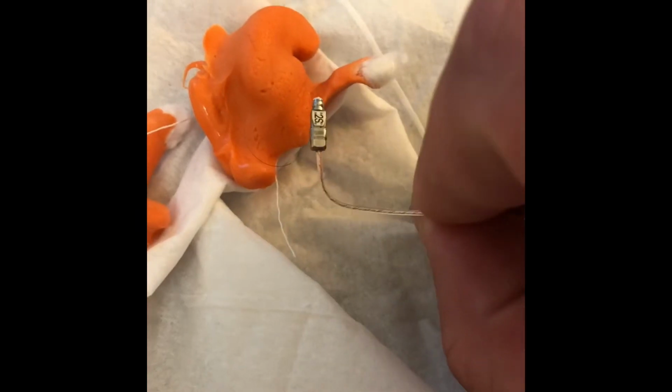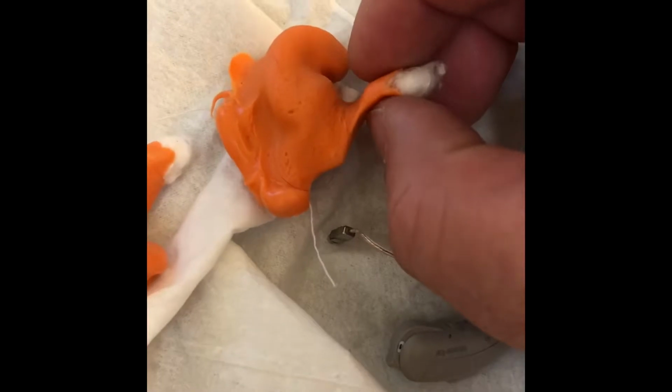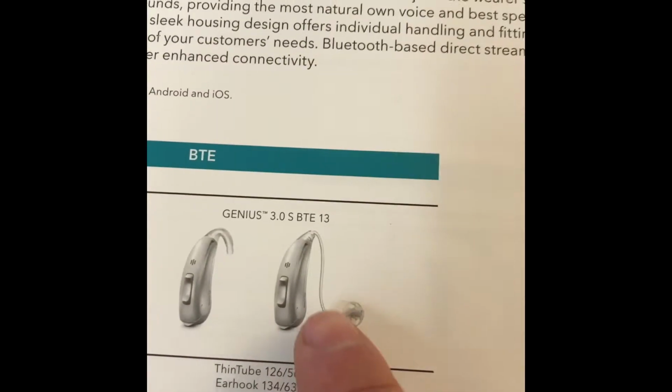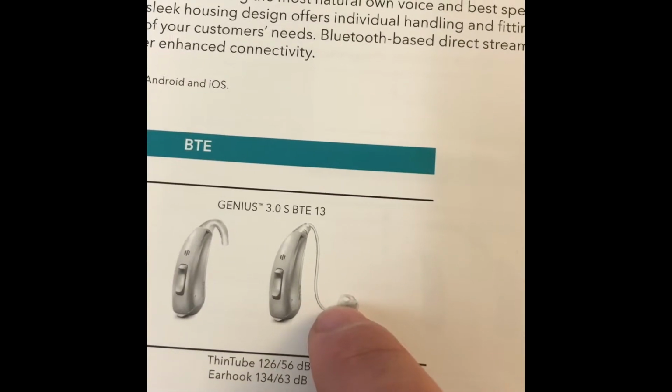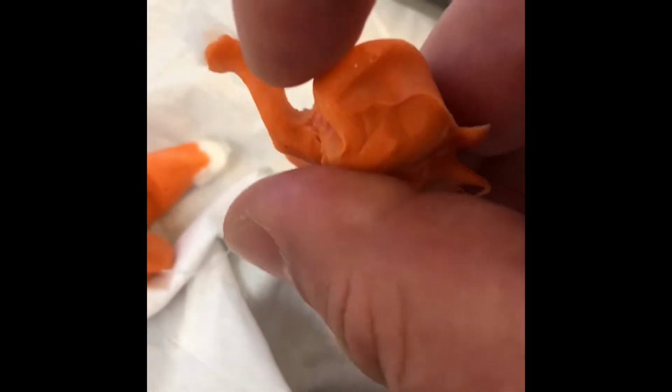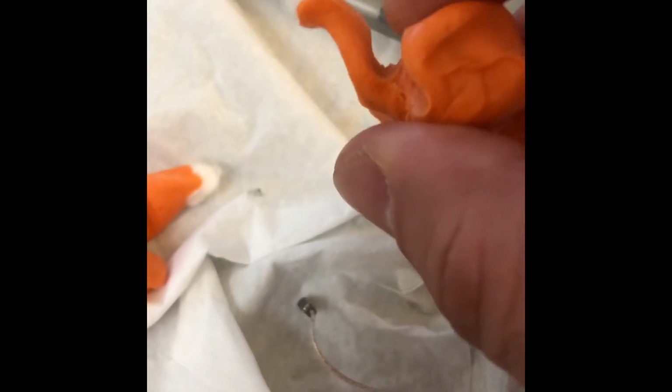Even though it's an S receiver, there's no way I can get an M or a P receiver in there. So what I'm going to have to do is get a behind-the-ear with the thin, open tube and make it fit. We have the little thin tube going into the canal, and enough room that it's not going to push out and be uncomfortable. I even have a little room for some venting, so it's not going to seal that ear very much. So that's one reason.